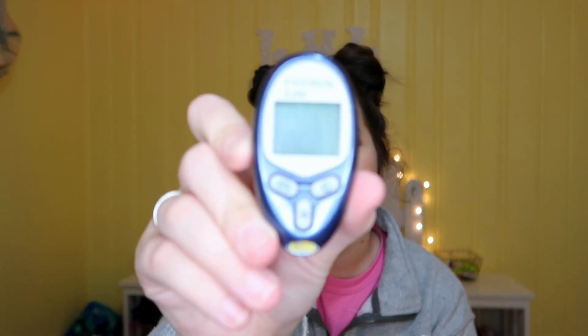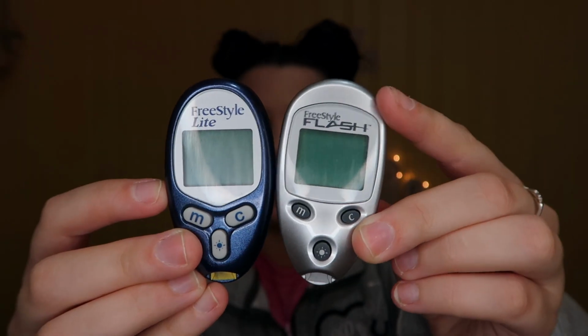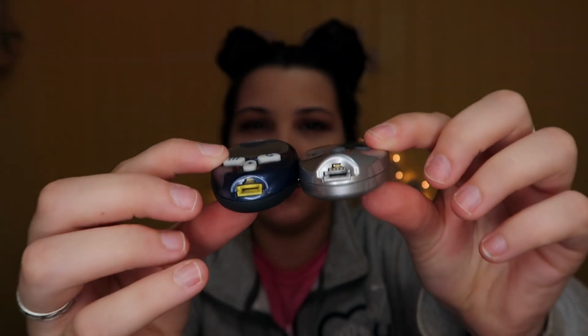The next meter that I used was the Freestyle Lite, and it looks like this. So the Freestyle Lite is an upgrade from the Freestyle Flash. It's a little smaller, a little thinner. It's also a different color, and the buttons are a little bit different, but it's basically the same meter. Uses the same test strips, takes the same batteries, but yeah. Those are the meters I used before I got my pump.